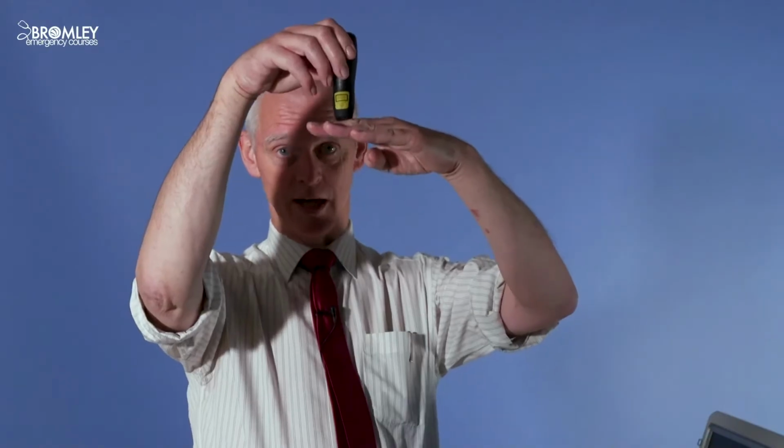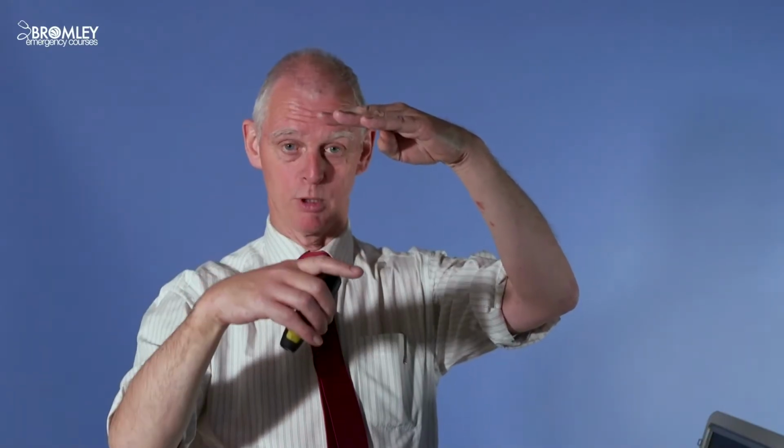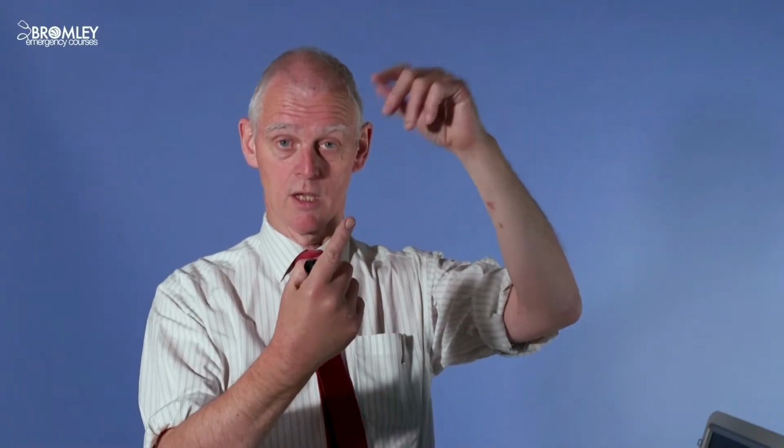So what's the relevance of that to ultrasound? Well, let me imagine that this is an ultrasound probe on the skin, and it's sending a beam into the body, and that beam hits a blood vessel, and there's red cells coming towards the surface. The beam hits the red cells and bounces back and is picked up by the probe, but its frequency has been changed by these approaching red cells, which have shortened its wavelength, raising its frequency. Honestly, it's not by a lot, but it is detectable.